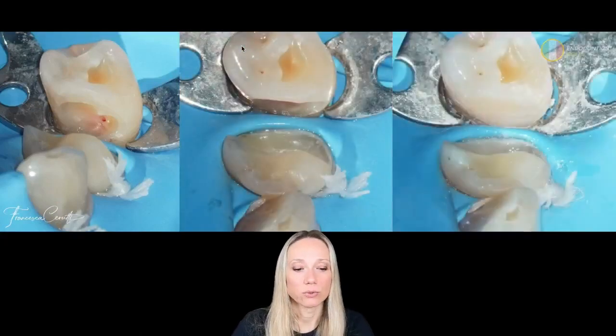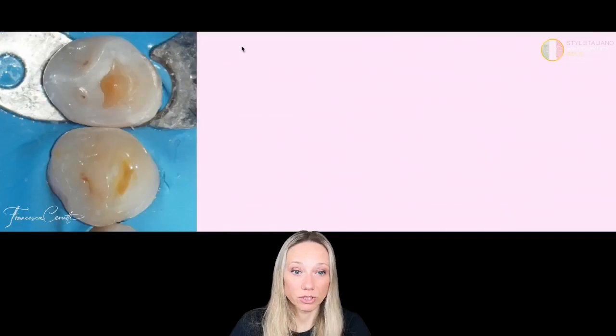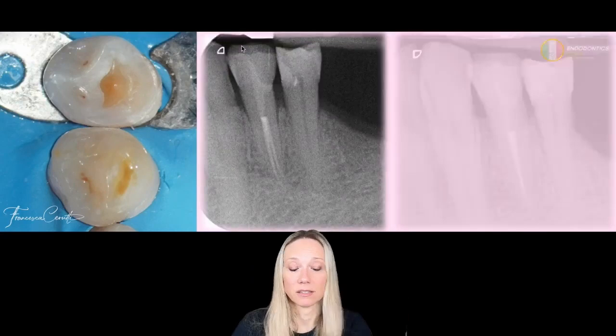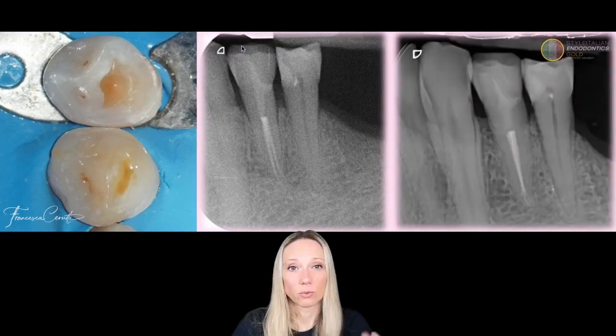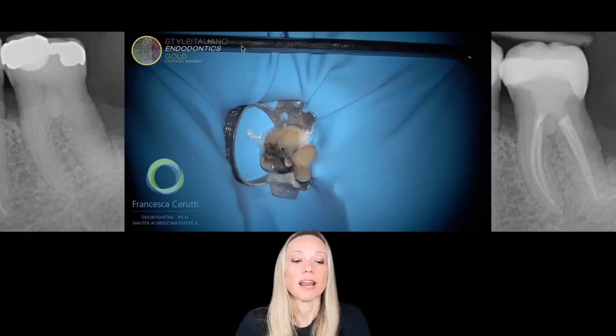And then I also do the direct pulp capping on the second premolar. Immediately I do the build up because I want to make an overlay on this tooth. And this is it. Immediately after, at 1 year follow-up. Still working, both the direct pulp capping and the root canal therapy. And so we see one last case.